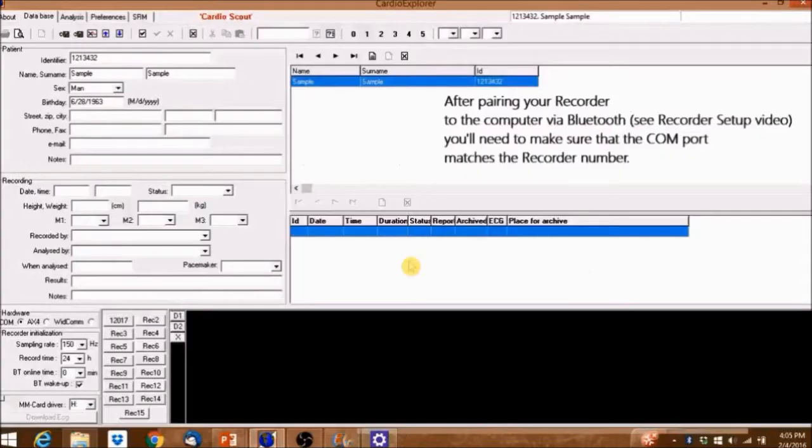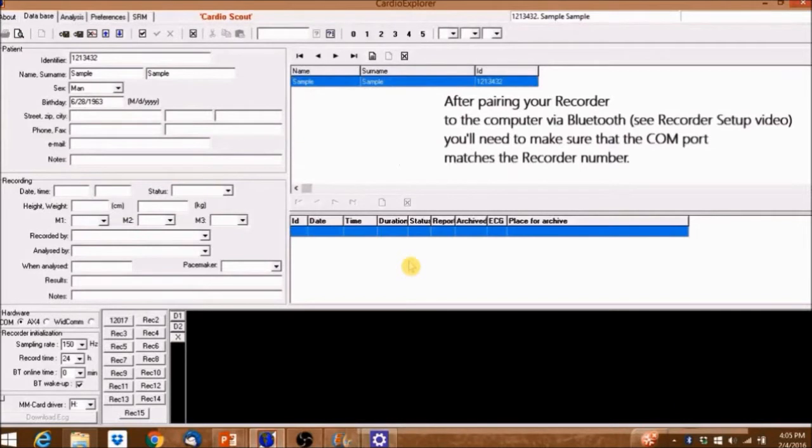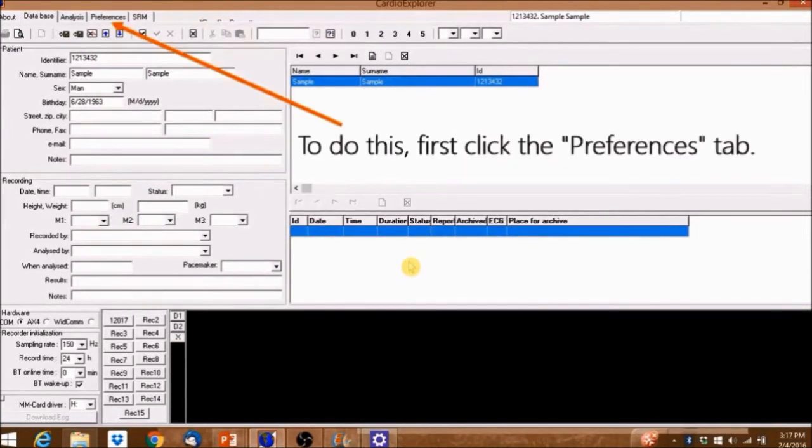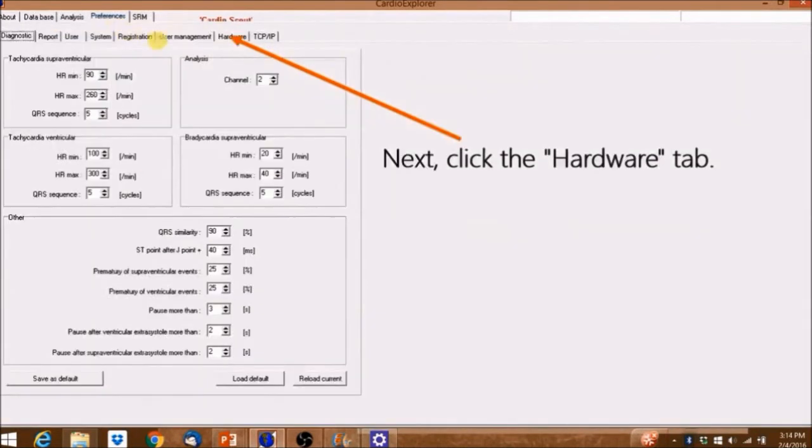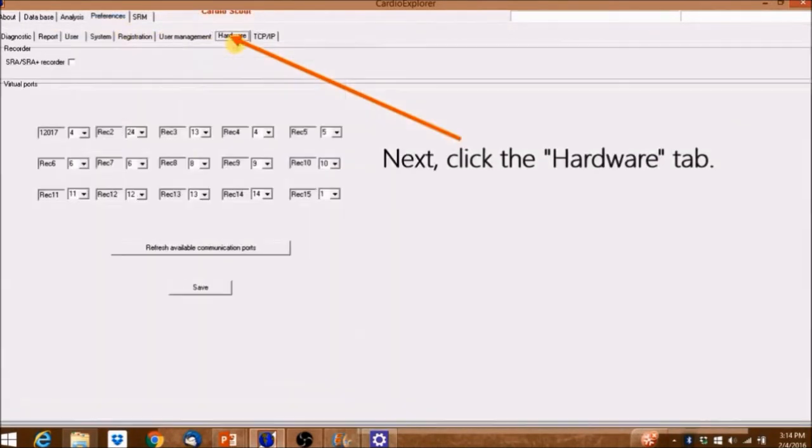After pairing your recorder to the computer via Bluetooth, you'll need to make sure that the COM port matches the recorder number. To do this, first click the Preferences tab, and next click the Hardware tab.